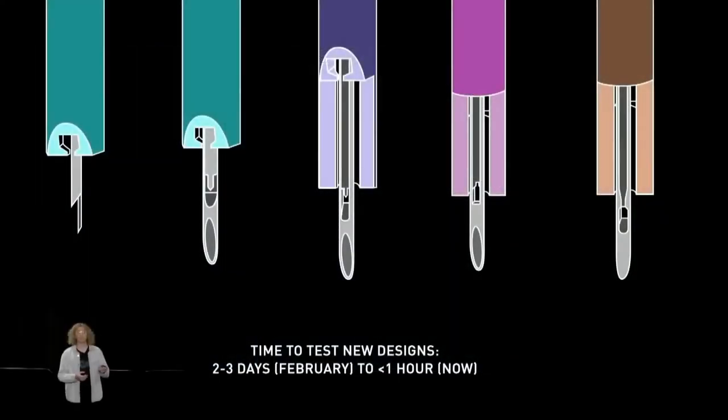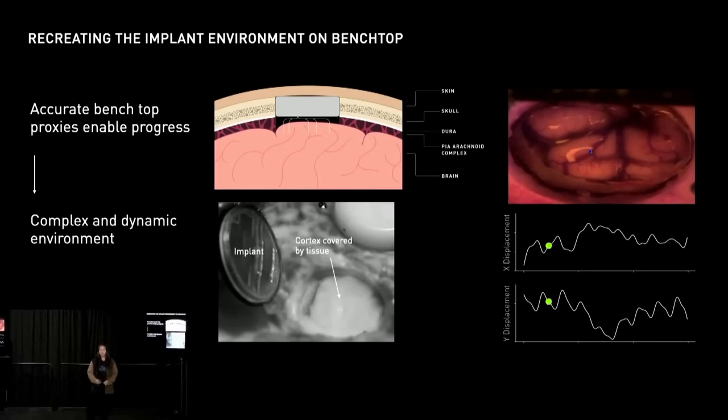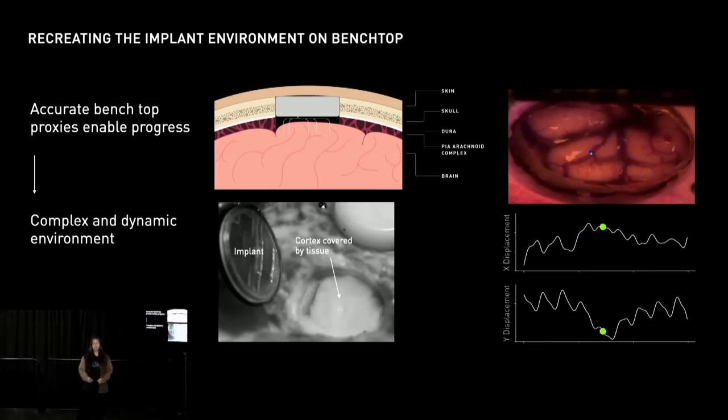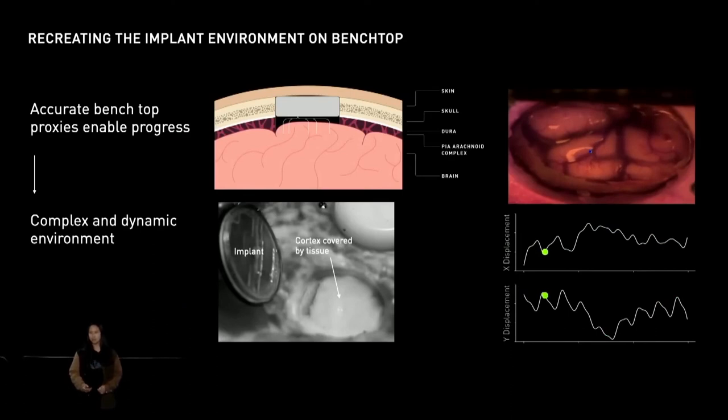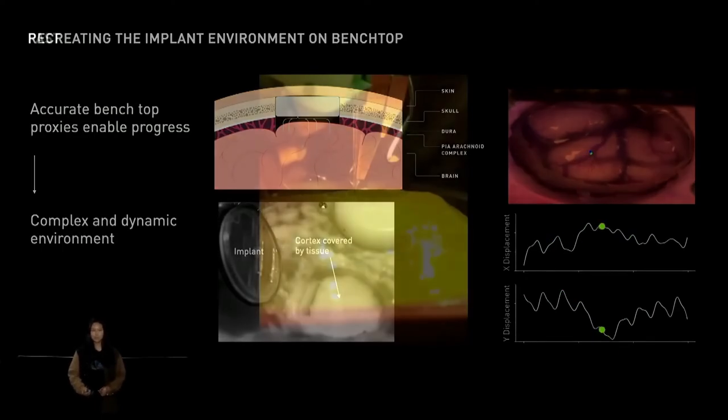This allows us to iterate in under an hour for new designs. The latest design, seen on the right, can actually insert through nine layers of dura totaling three millimeters on the benchtop. This is far more than we could ever expect in a human with significant margin. We're developing synthetic materials that mimic the biological environment. This allows us to learn as much as we can on benchtop and start taking steps away from the industry standard of animal testing. Developing accurate proxies, though, is challenging.